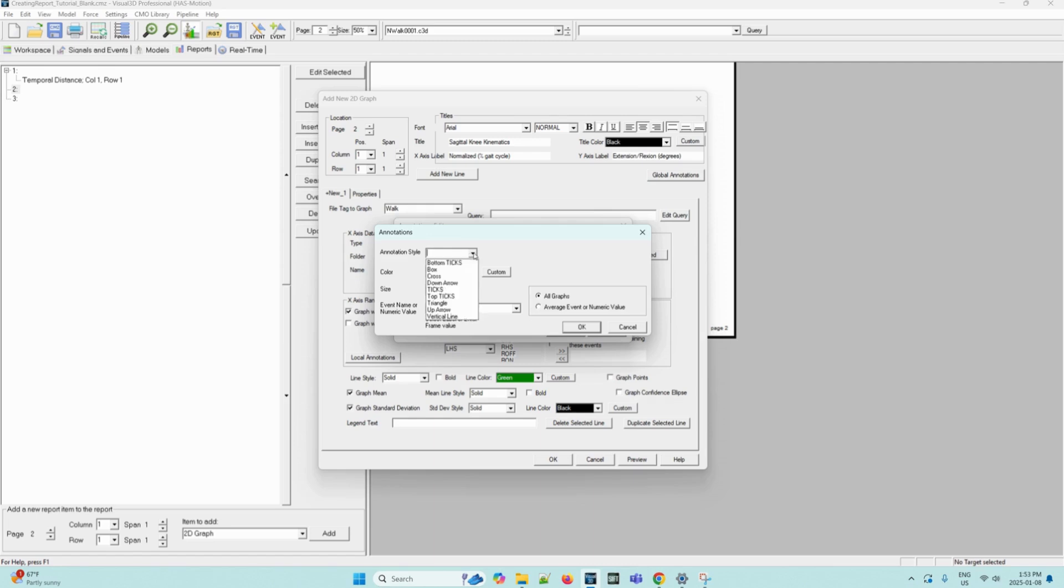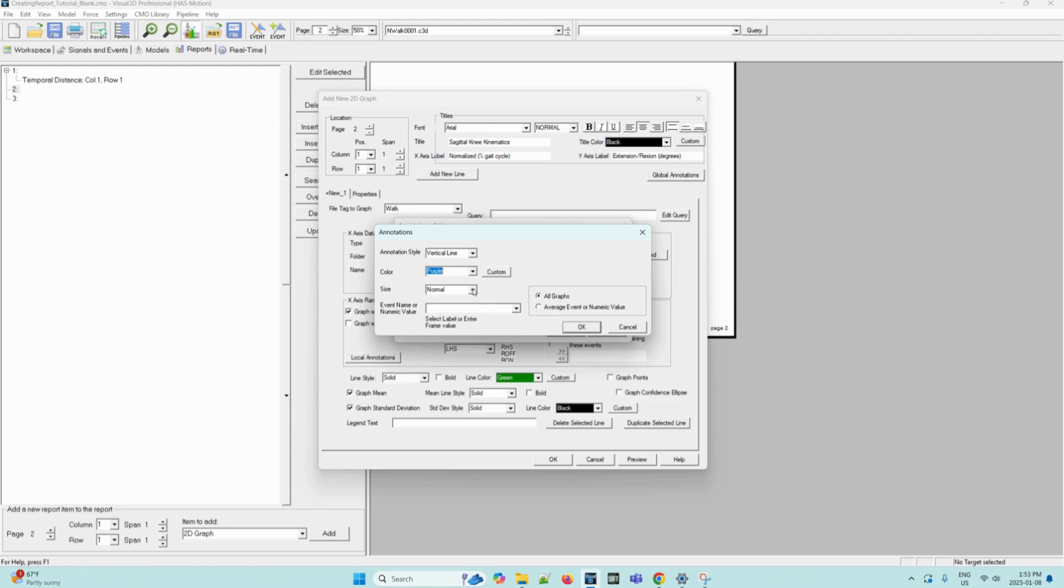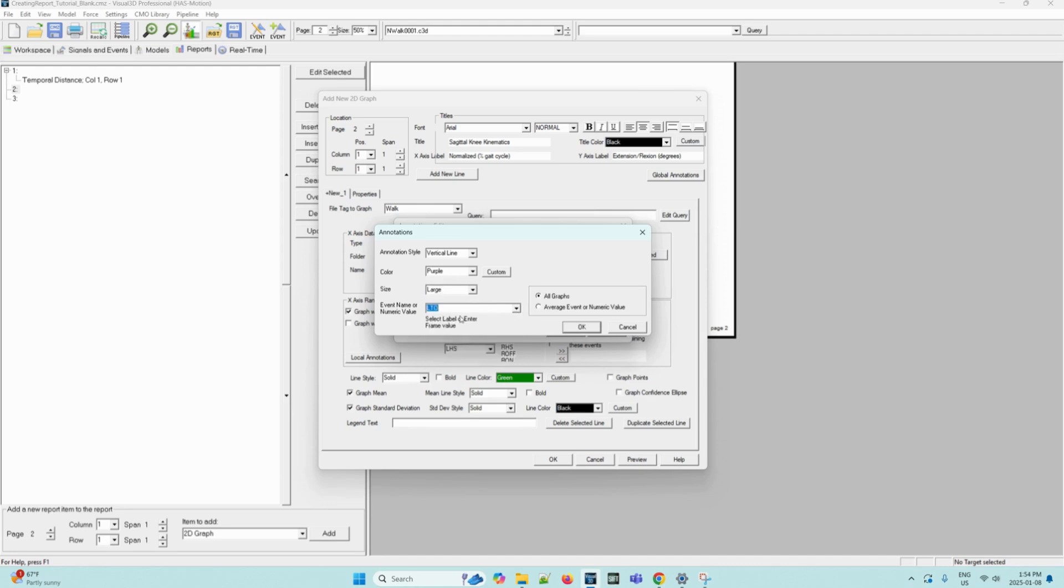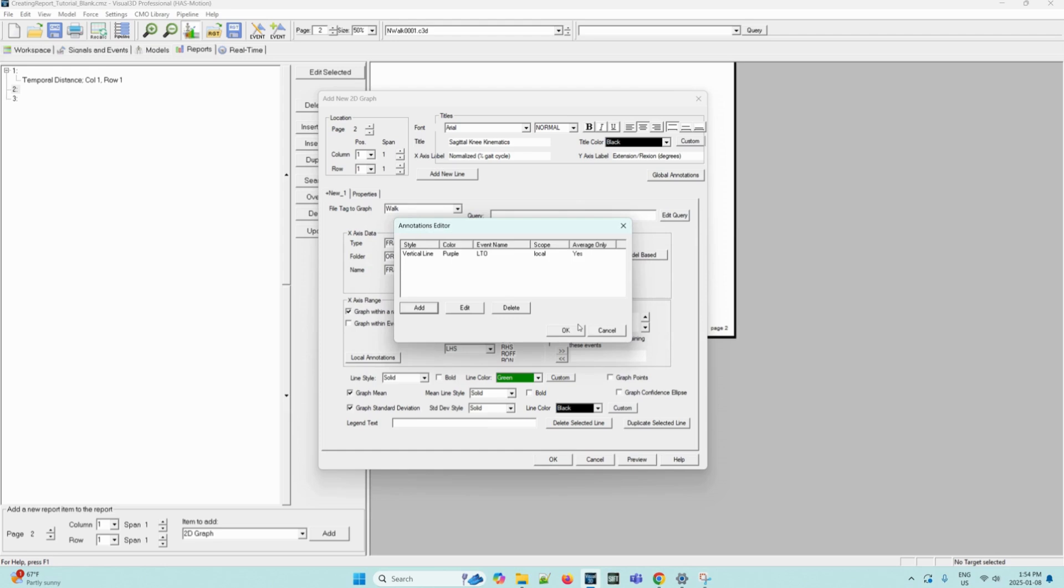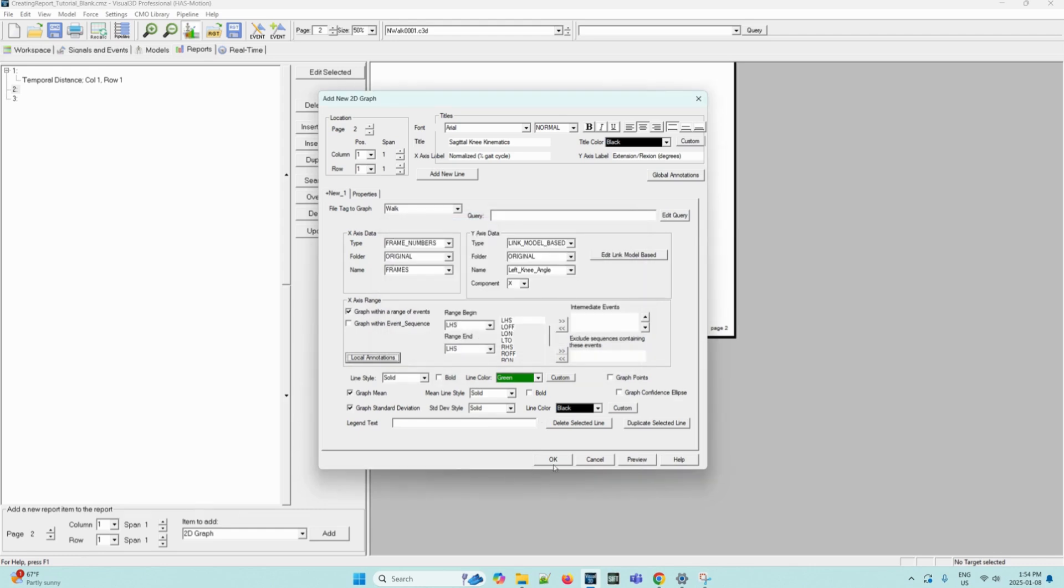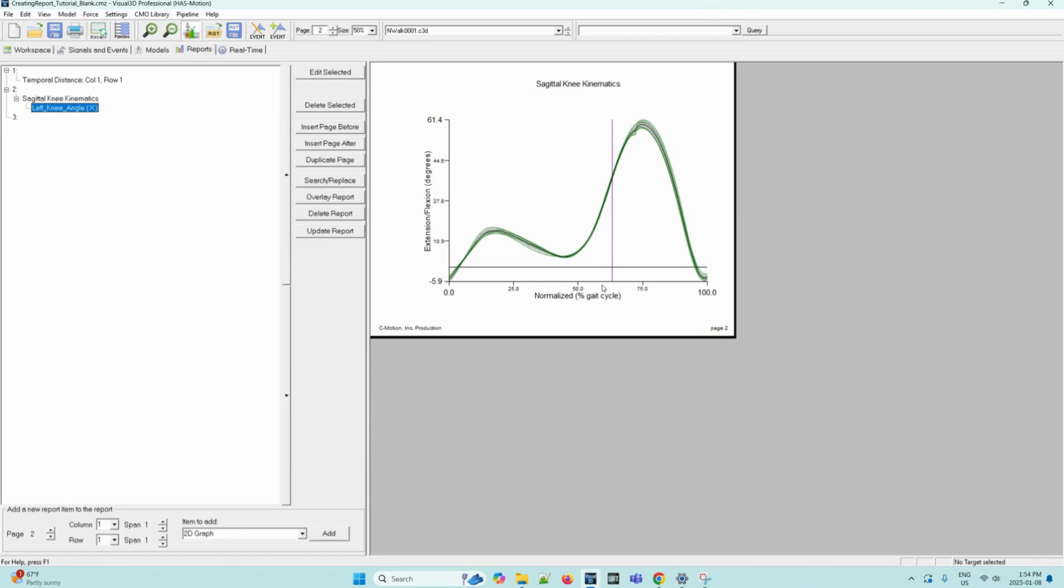For the annotation style, we can select a vertical line. The color will be purple. The size will be large. The event name or numeric value will be selected as LTO or left toe off. And then we can select average event or numeric value. Then select OK. This annotation should now appear in the annotations editor dialog box. Select OK in the annotations editor dialog box. Now we can press OK. And the following graph should appear on page two.